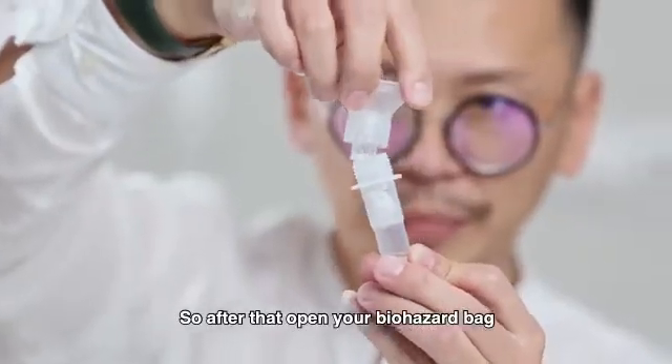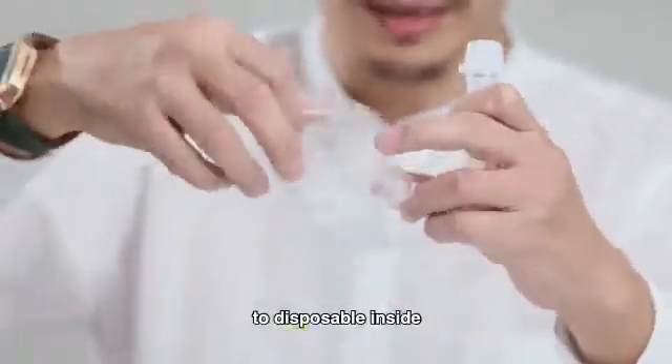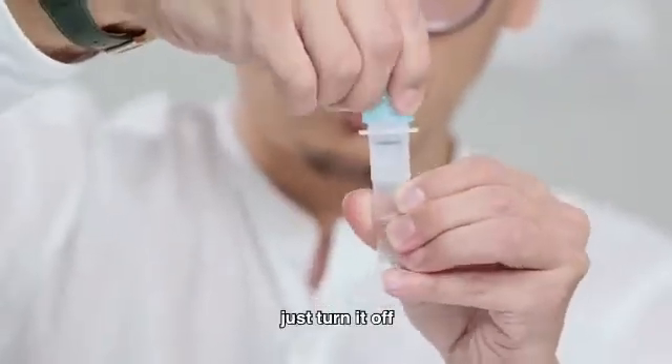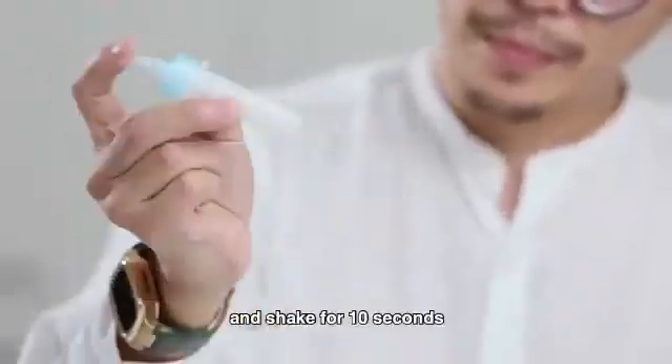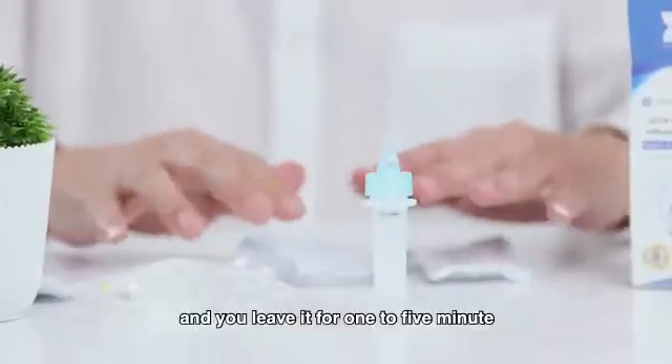So after that, open your biohazard bag to dispose the swab inside, and replace the blue cap. Just turn it up. And shake for 10 seconds. Then leave it for 1 to 5 minutes.